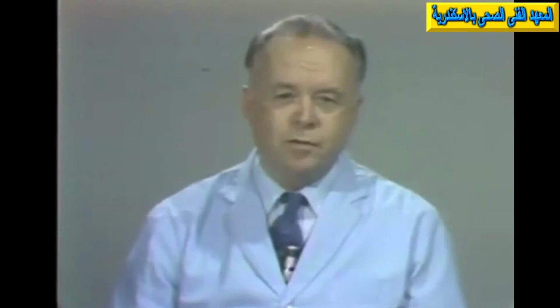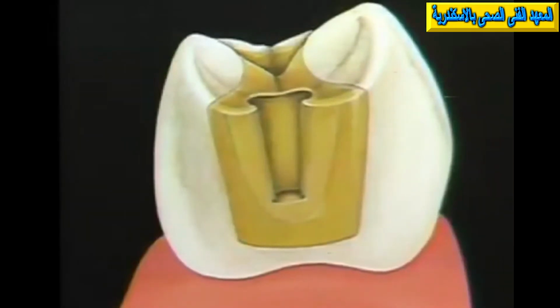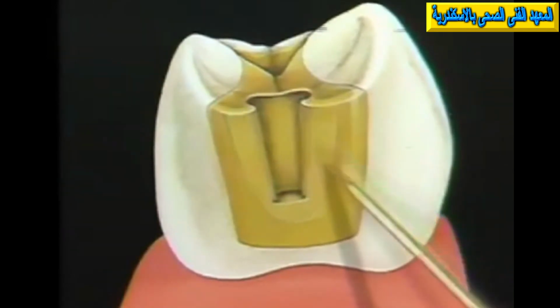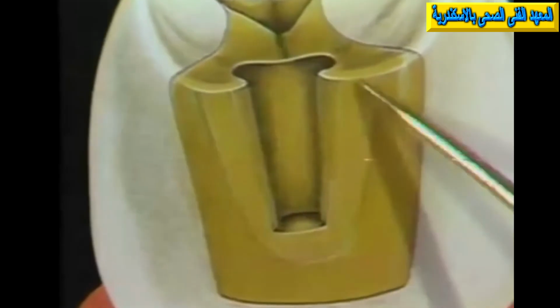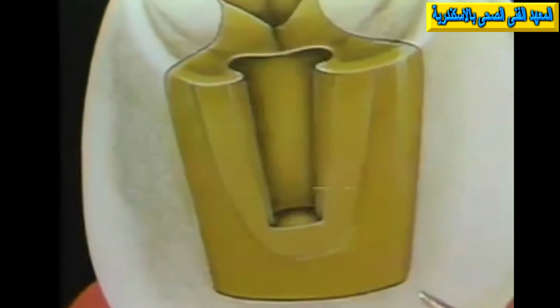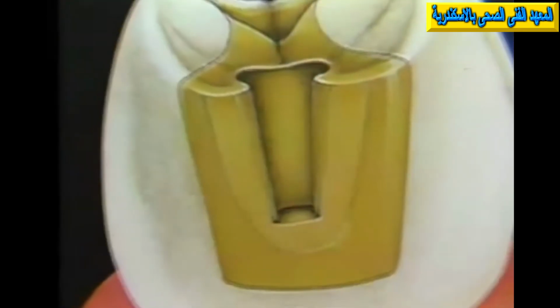The preparation of the keyway has been visualized from the occlusal surface, and perhaps it's helpful just to return to a proximal view of the finished keyway. I think you can recognize the characteristics now, the length being about twice the width of the preparation. Here is the facing. Notice the degree of taper and the retentive key form, the rounding of the entrant and axial line angles, and the preparation is now ready for waxing.